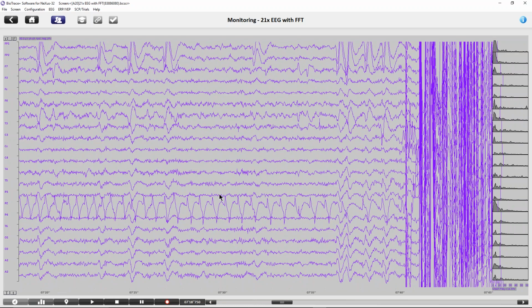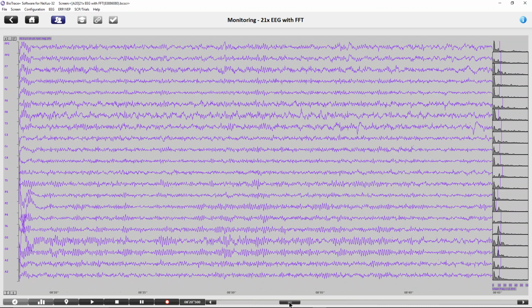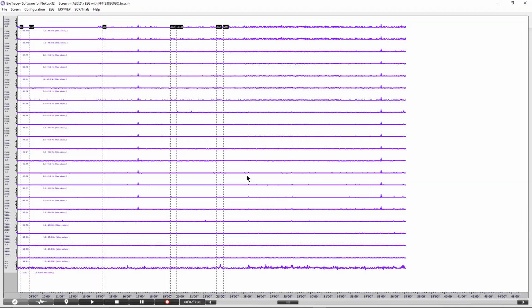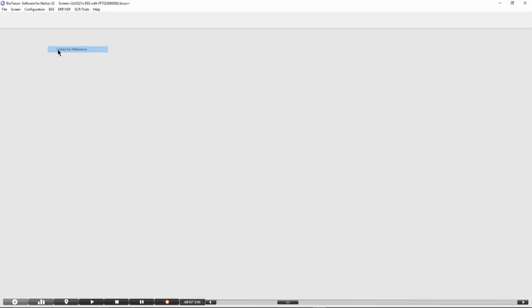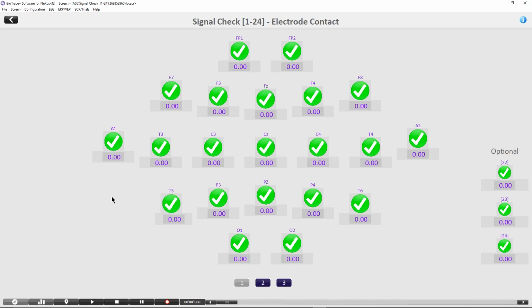You can see we've got a bad signal right there, so we've got to correct that. Once we get past that, we can tab to the review and see where we are, and tab back. We can go back to our linked ear reference and look at our connection values, and we can replay that.